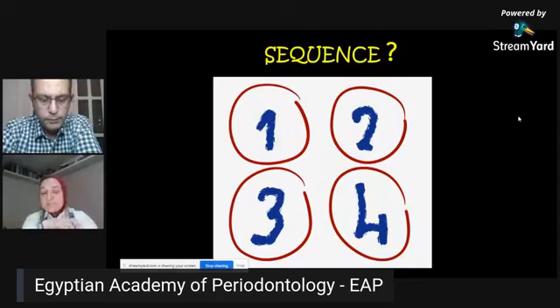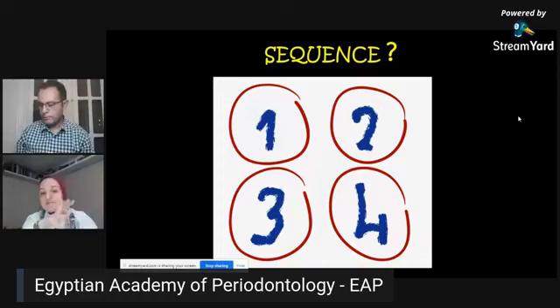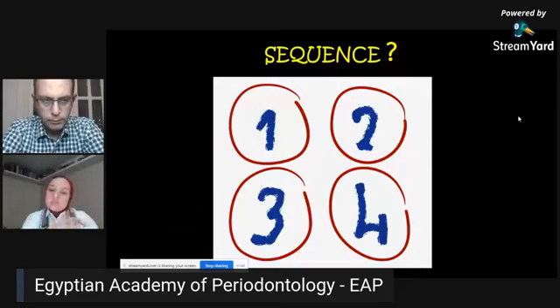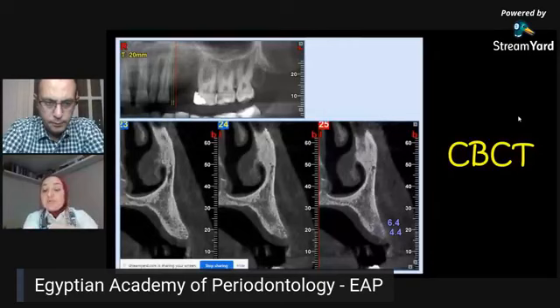and the population we see, mostly with deficiency of vitamin D and deficiency of calcium, malnutrition and not that good hygiene, I would like to wait enough to make sure that those implants are osseointegrated. So for me, the longest treatment plan is the implant treatment plan. So we started with the implant insertion first, and then we did the frenum to be able to do the aesthetic crown entry. Let's see how it goes.